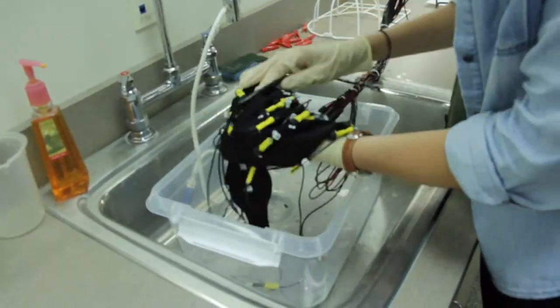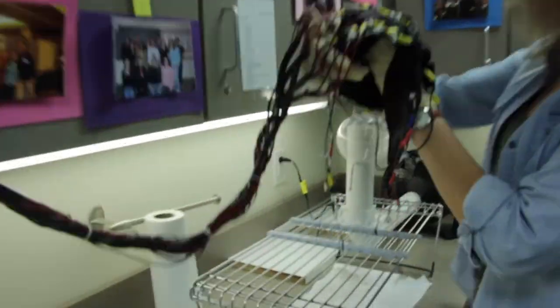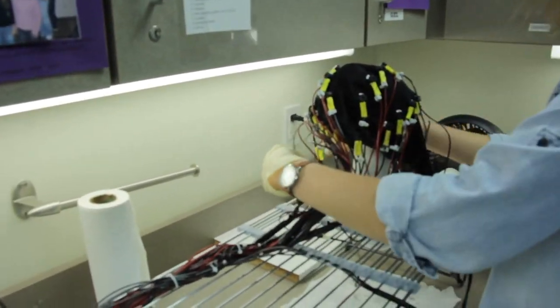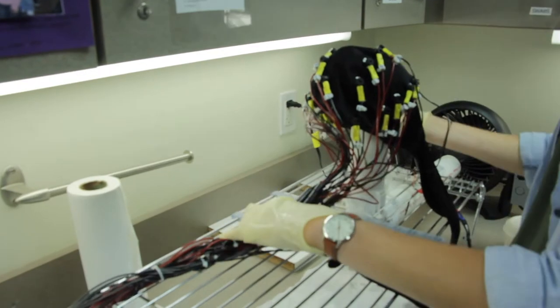Carefully transfer the cap from the wash tub to the dryer. Put your hand underneath the cap to support it. Do not hold the cap by the cap material as it can stretch the cap or the electrodes may pop out.